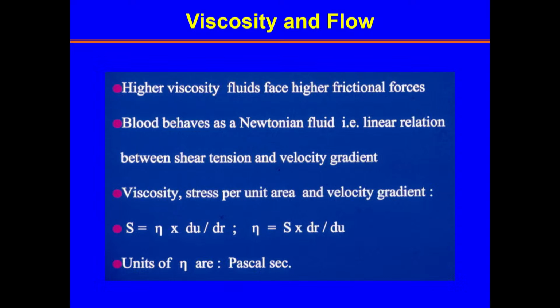And here we can express the relation between the shear tension and the velocity gradient. The velocity gradient here is a gradient of velocity over a distance, not over time. They are directly related, and the constant is viscosity.